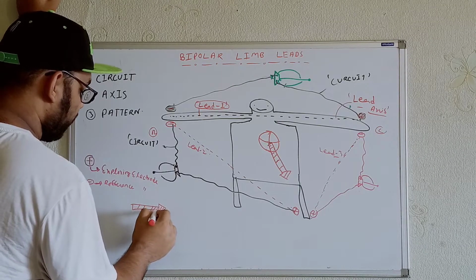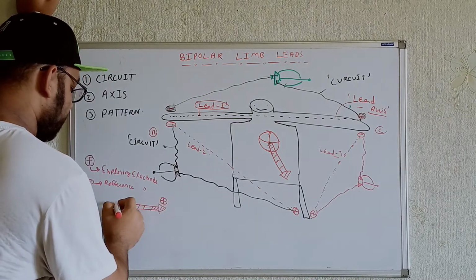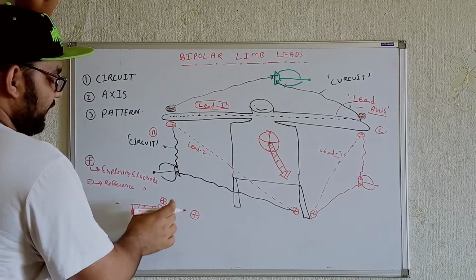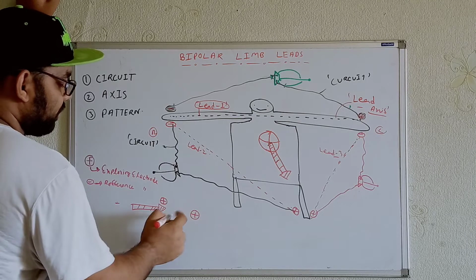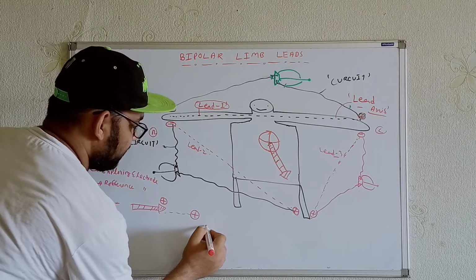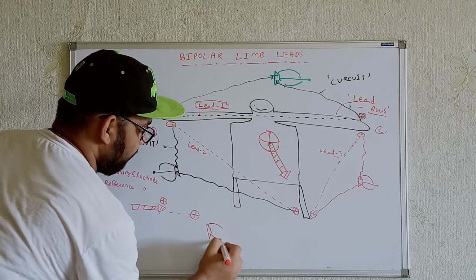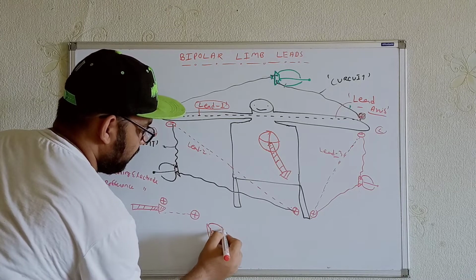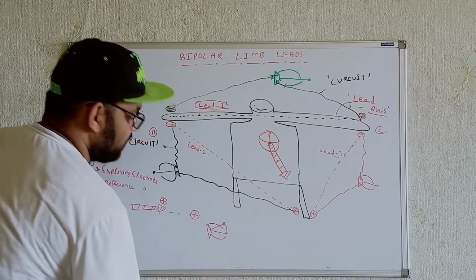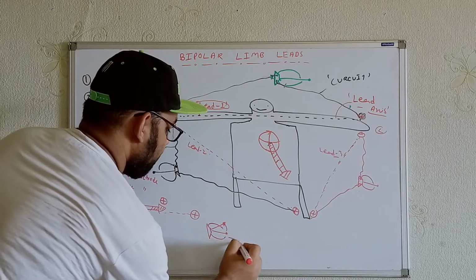Now whenever it goes toward the positive, you have to consider it in terms of the positive electrode. Whenever the positive electrical vector goes towards the positive electrode, at that time we will see the deflection be positive, which means it will come upward just like this. So we will see positive deflections in the ECG.